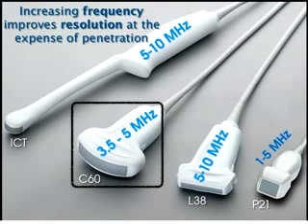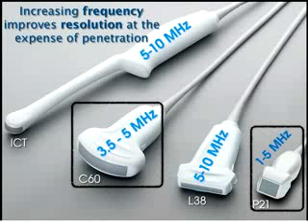If we didn't have that probe, but we had instead this small footprint phased array transducer that's usually used for the heart exam, we could use that as well. However, that larger footprint probe definitely gives us better resolution at that wide angle.